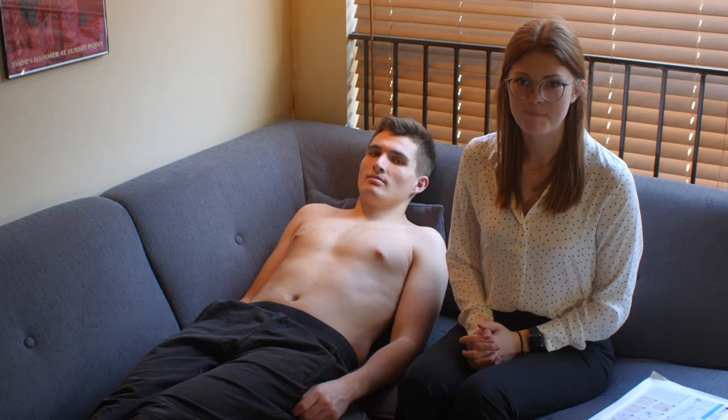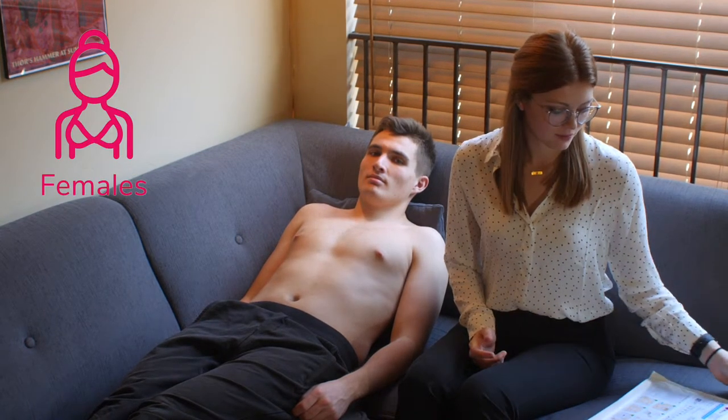Make sure to relax in a comfortable position for at least 5 minutes. Males should lie flat without a shirt on, while females are advised to lay flat with their bra on.